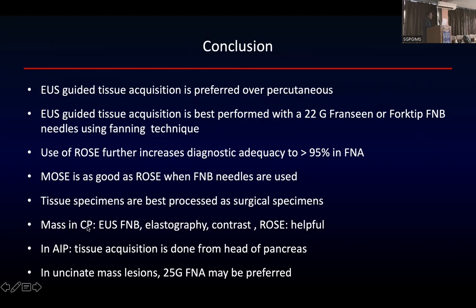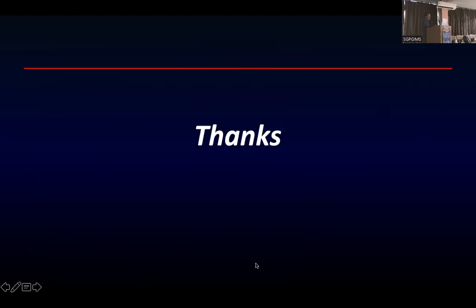Mass in chronic pancreatitis, FNB should be preferred. Elastography that we discussed would be preferred. And ROSE may be helpful in this scenario. Again, in uncinate mass lesion, as I mentioned, when you're doing a transduodenal puncture, 25 gauge needle may be preferred. Okay.